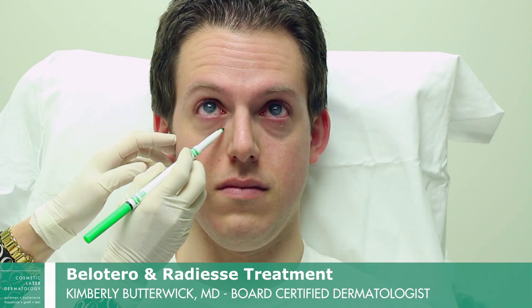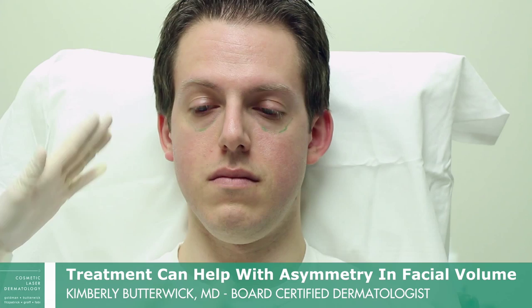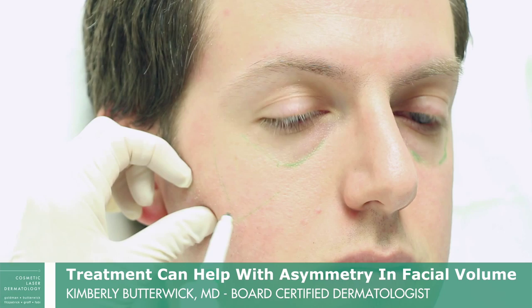We're going to want to put some volume in this area on him, and that will really help him not look so tired. And if you look at his face, this side of the cheek — his left side is fuller than the right — so we want to try to balance the face a little bit.